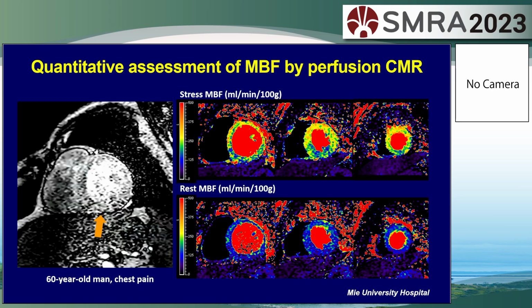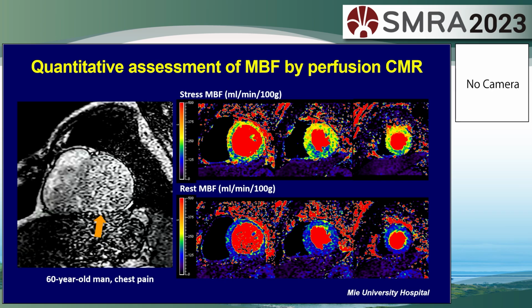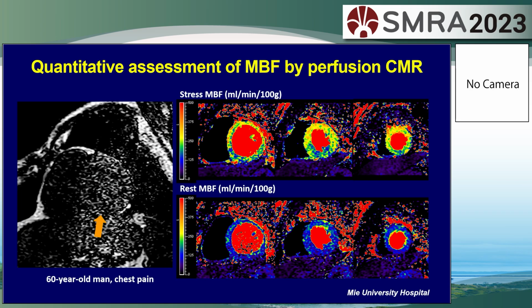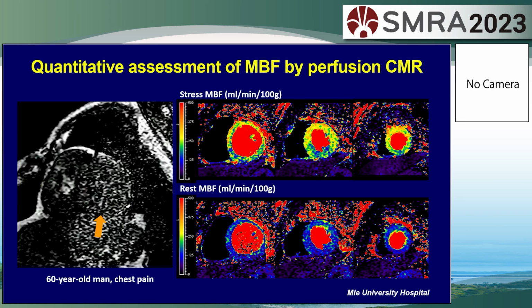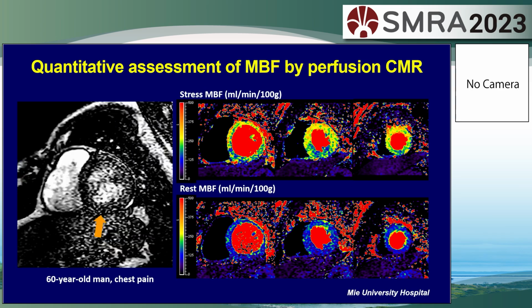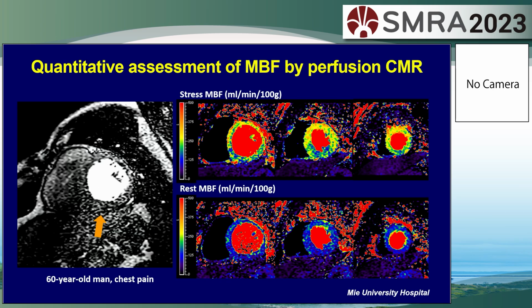And if we can measure the global flow from the ordinary perfusion images, that would be great, because the total study time of the CMR is not prolonged.